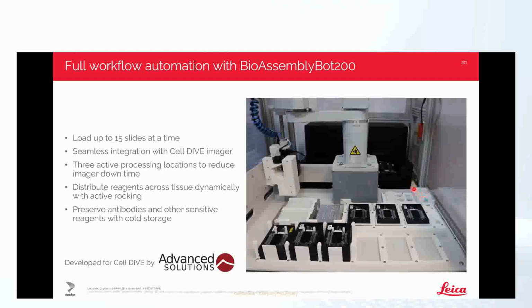If you're looking at whether antibodies can be multiplexed together, like if you have 60 markers, you have to repeat this process many times. So we do 4 colors plus DAPI at a time, so if you're doing 60 markers, that's going to be 15 rounds, right?